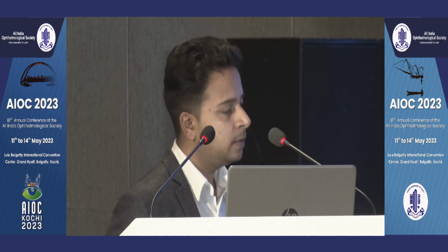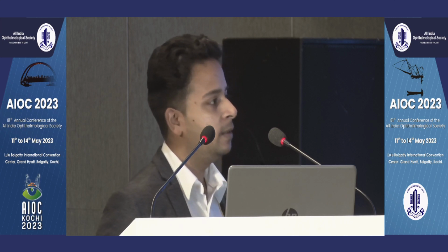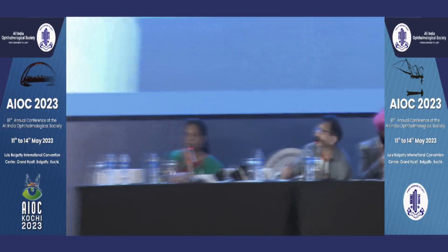The indices are already there. It's not your weightage that matters. It's the software that has been input in that machine for all the false negative, false positive, fixation loss and all that. It's already there. Your interpretation doesn't matter. If he takes that printout anyway, he'll see that printout. He's not going to bother about your interpretation.